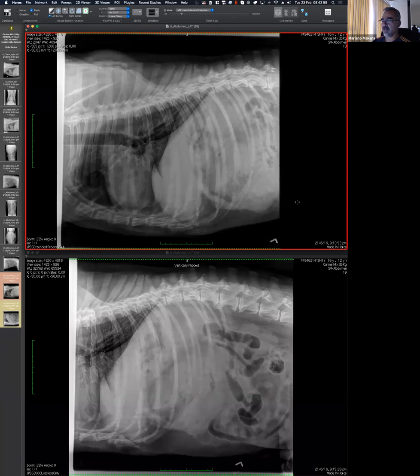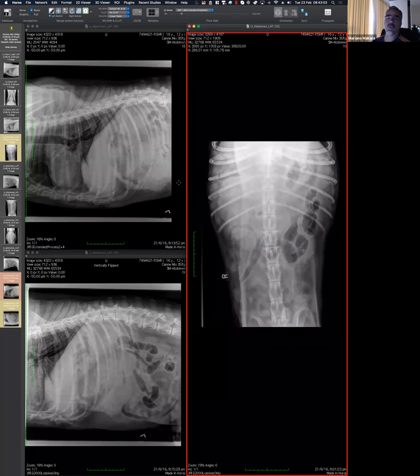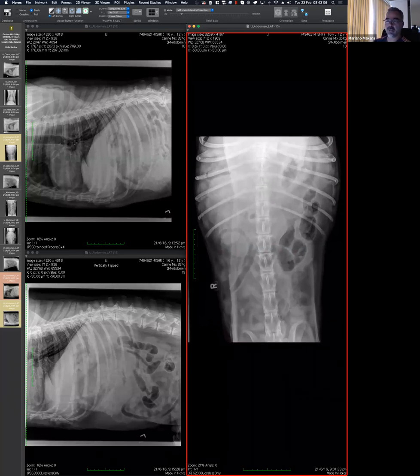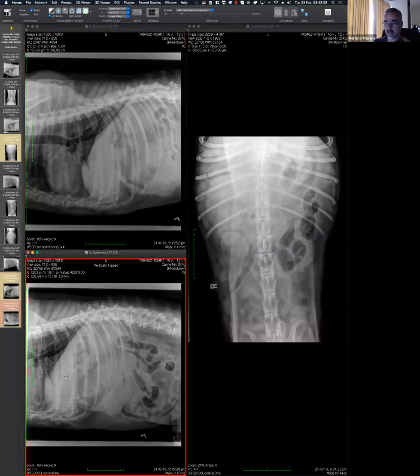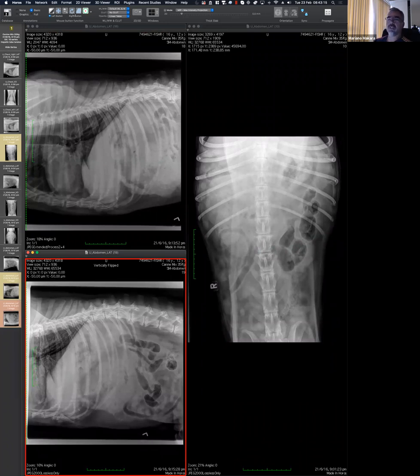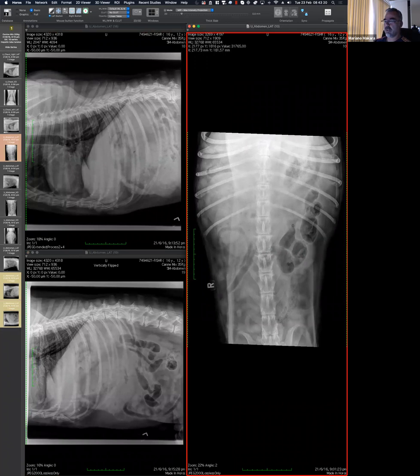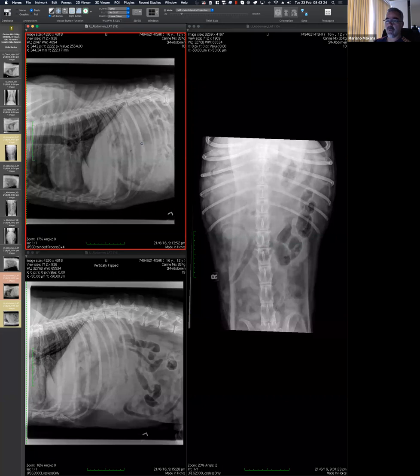And I think, well, there are a couple of things. This is an extremely interesting and extremely unusual case. That's why I don't have any expectation to get to the right answer. But they are very interesting findings. So we can get started today, and then I'll post this one, so you have the time to look carefully at the images, and then we can continue discussion next time if we don't finish.